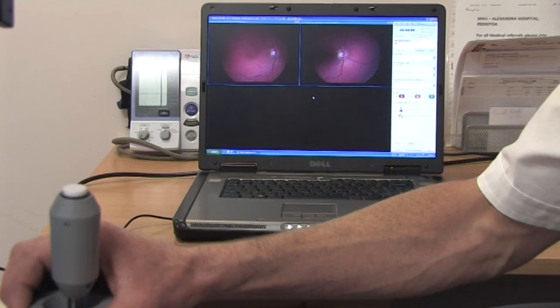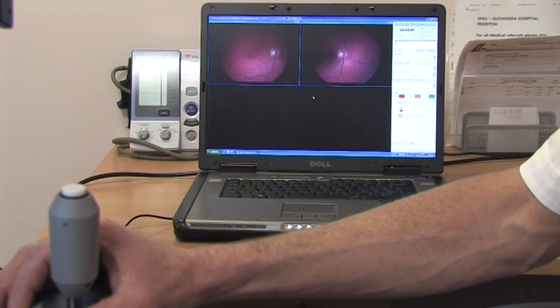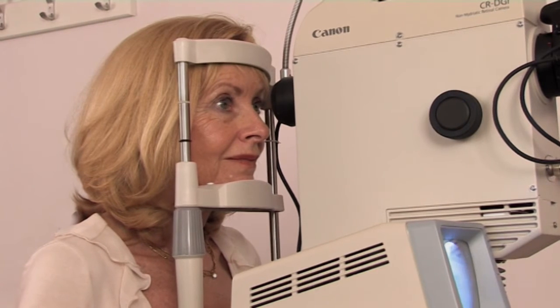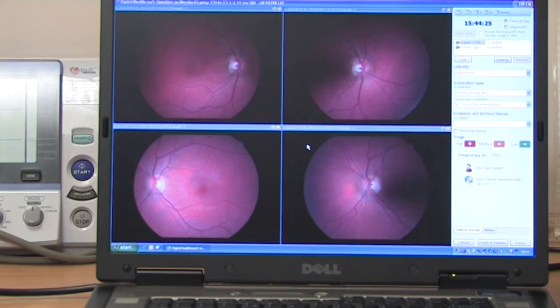I'm going to move over to your left eye now, and we'll do the same again — starting with the little orange light. Both eyes nice and wide, and just stare at that little light. There we are, now back to the little green one. Keep your eyes on the green one. And then once again, back again with the orange light, and the little green — or it might be a purple one now — moving away to the right of the camera. Just follow that all the way across. Hold that nice and steady.